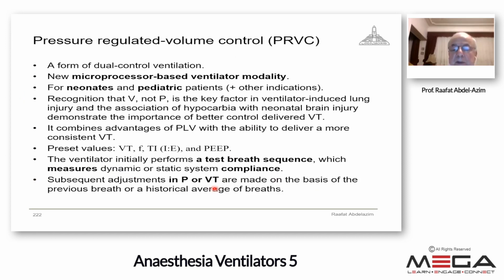To avoid the disadvantages of each one, we have a new form of ventilation that's called pressure regulated volume controlled or pressure regulated volume guaranteed. That is, we adjust the required tidal volume, but the changes in the patient's pressure will be sensed by the ventilator.